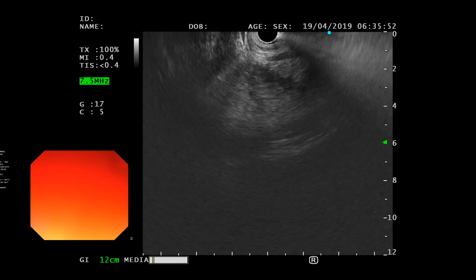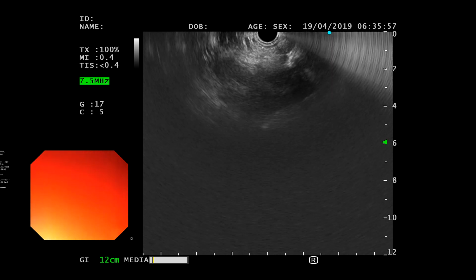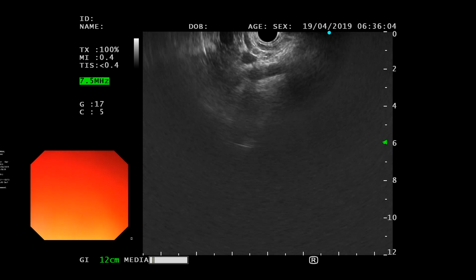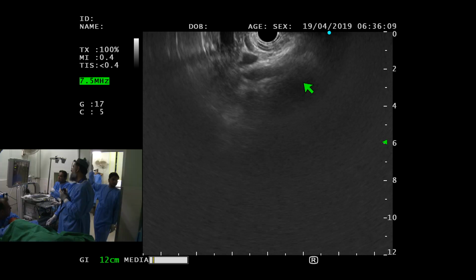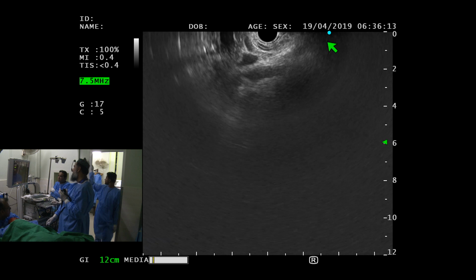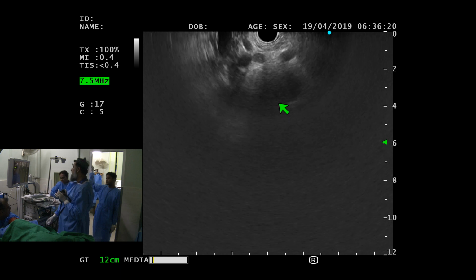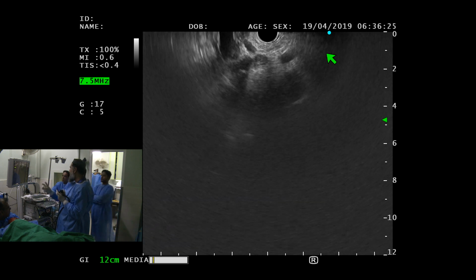As long as you are able to identify the anatomy, you have to follow the anatomy. Now, in order to go to the spleen, you have to identify the splenic artery and follow it down into the splenic hilum. Obviously the spleen is going to come somewhere here. It can come down here, but generally when the pancreas is visible, the spleen has to be here, the kidney has to be here. So you need to identify the kidney, the spleen, and either the duct or the splenic artery so that you can follow it.